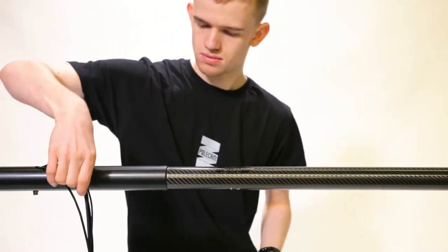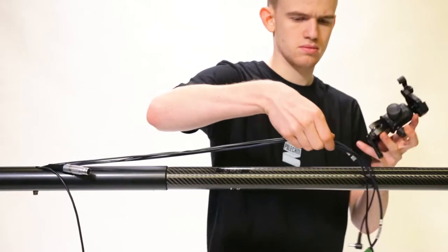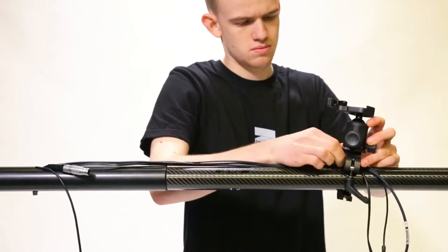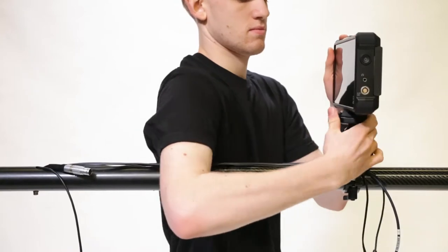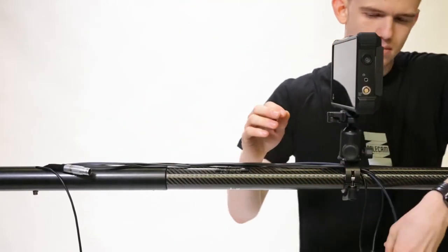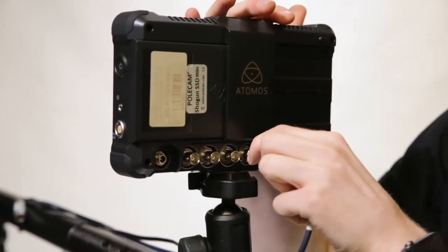Now attach the monitor clamp to the rig, passing all the cables under the strain relief inside the clamp. Mount the monitor to the clamp using the quick release plate and connect the SDI, audio, and power cables as shown.